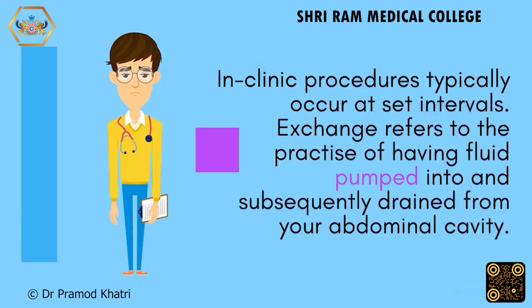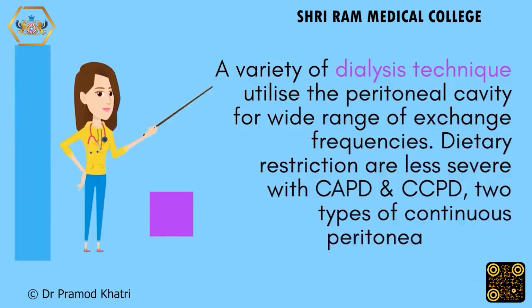Exchange refers to the practice of having fluid pumped into and subsequently drained from your abdominal cavity. A variety of dialysis techniques utilize the peritoneal cavity for a wide range of exchange frequencies.